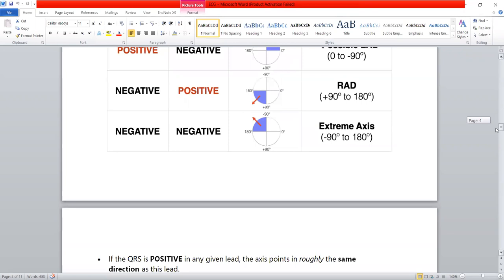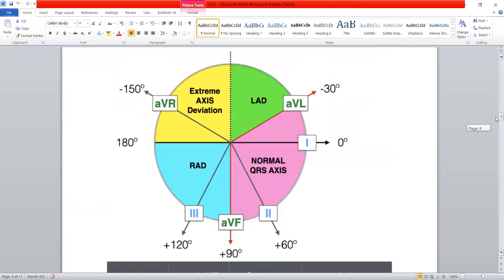In the final situation, the QRS complex is negative in both AVF and lead one. Both have a negative QRS complex. The current is moving away from lead one towards the right, and upward away from lead AVF — which is extreme axis deviation, or extreme right axis deviation.